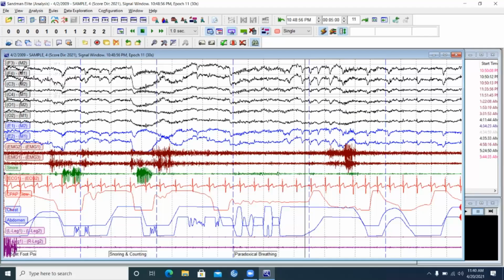Obstructive, yeah. And this is actually mimicking the paradoxical motion that we see during obstructive apneas, where typically when we breathe, our chest and our abdomen are in sync with each other. But when you're struggling to breathe against an occluded airway, you have that obstructed or paradoxical motion of breathing, where you see the chest and the abdomen belts get out of sync with each other because you're struggling to breathe against an occluded airway.